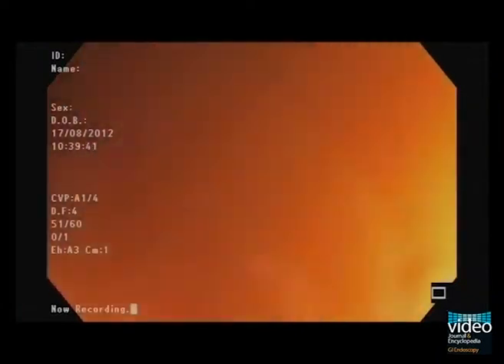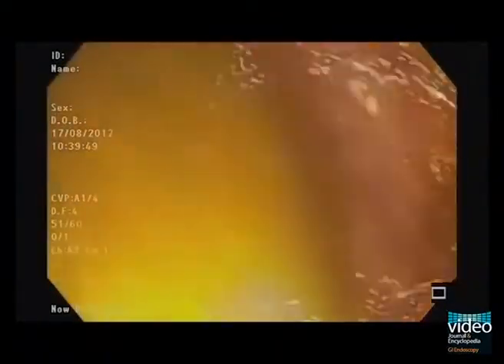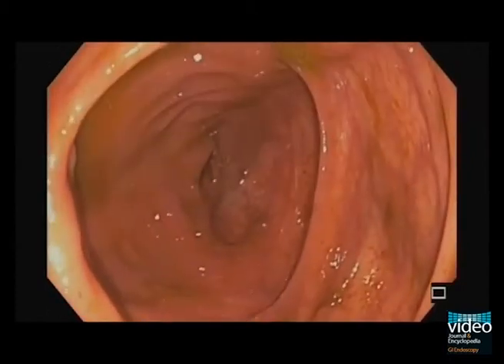The pole of the cecum, often contaminated with bowel content, when cleaned may reveal the triradiate fold, which is the fusion point of the 3 teni coli. The appendix orifice is noted. The ileocecal valve is located at the medial or posterior medial wall. An arrow drawn on the bow of the appendiceal orifice will usually point to the ICV orifice.